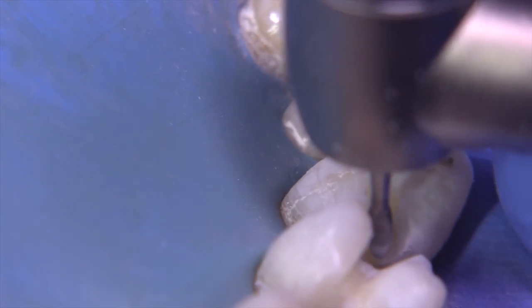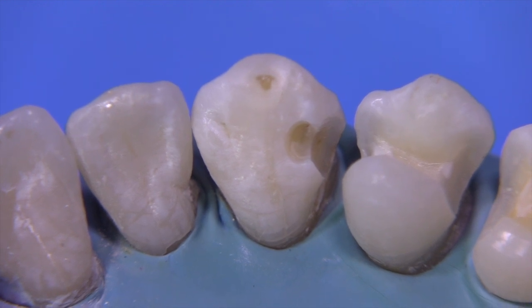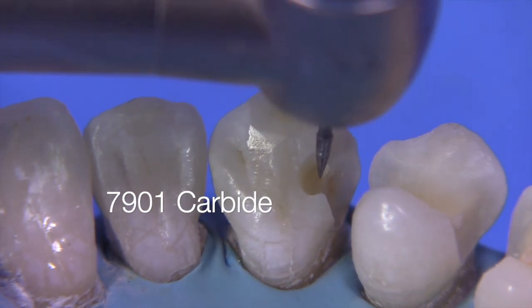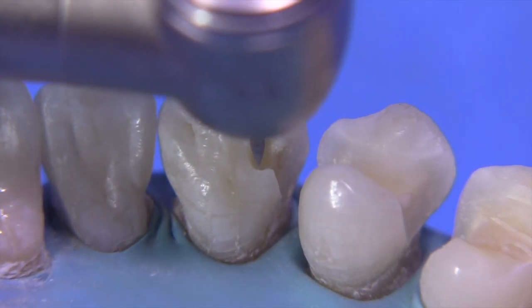You can verify your draw by taking the burr and moving it up to the lingual area, making sure everything's going to draw okay. The preparation is getting close to being finished, but there are some undermined enamel areas and maybe some areas where we want to increase the taper just a little bit. For that, the 7901 is very helpful.